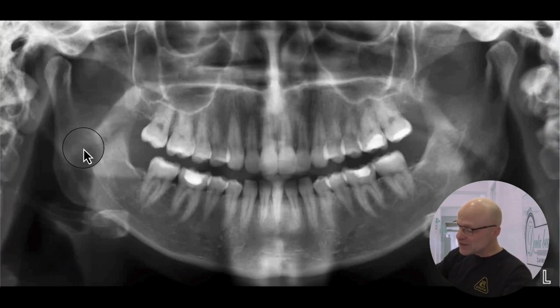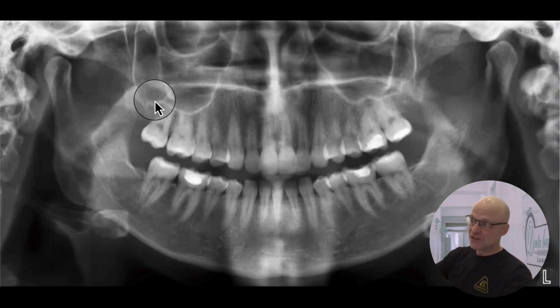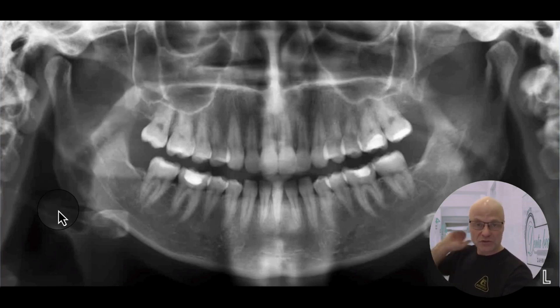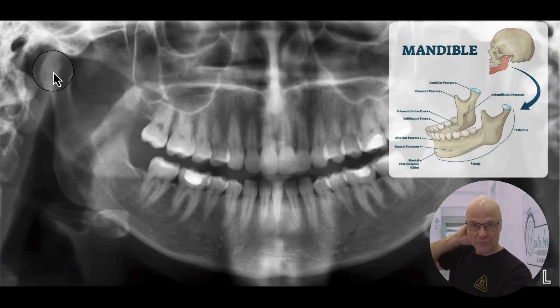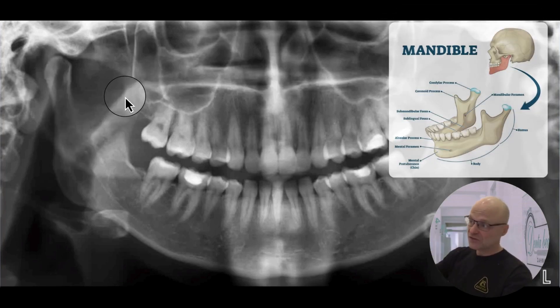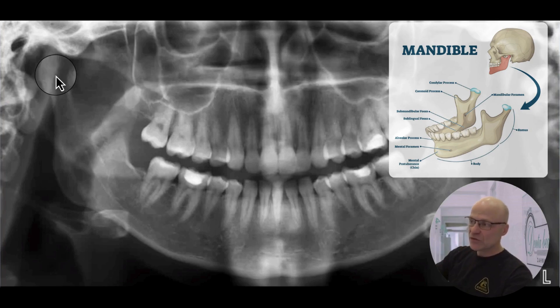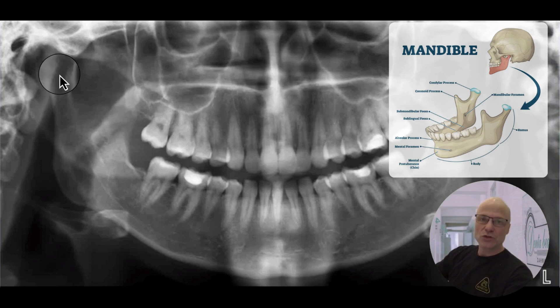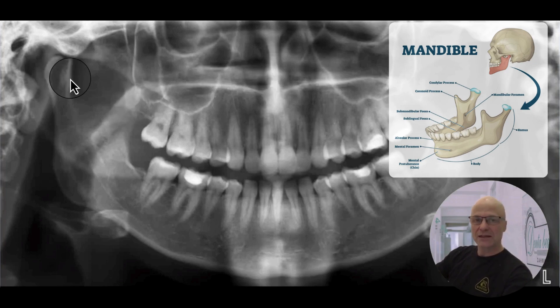This area is the soft palate, which then merges into the root of the tongue. Now let's look at the lower jaw and explore the features of the mandible, where you'll notice the two condylar processes and the two coronoid processes. These structures play crucial roles in jaw movement and functionality.